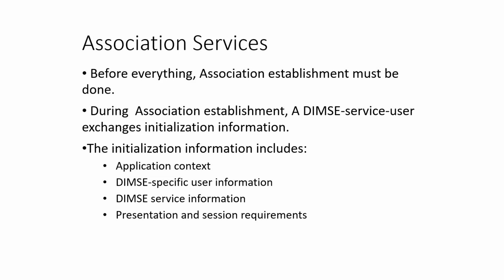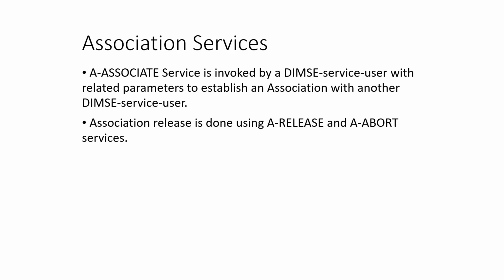The initial information includes the application context, the DIMSE specific user's information, the DIMSE service information, and presentation and session requirements. Association services.